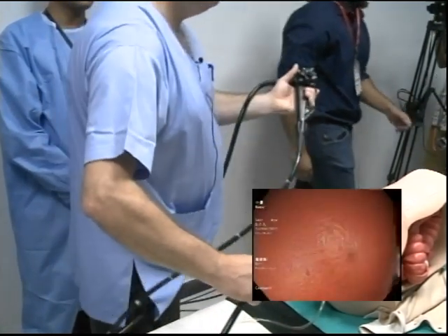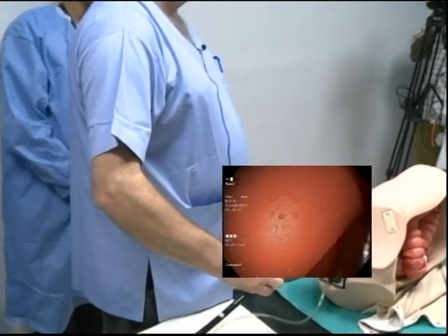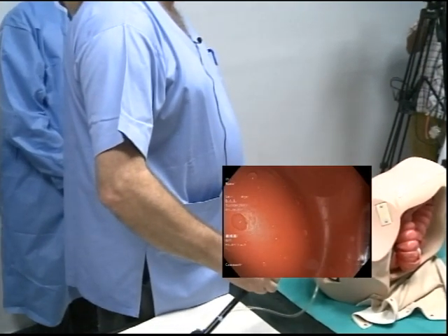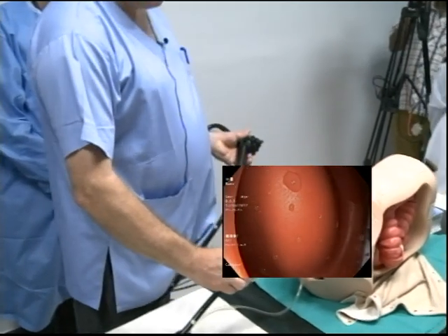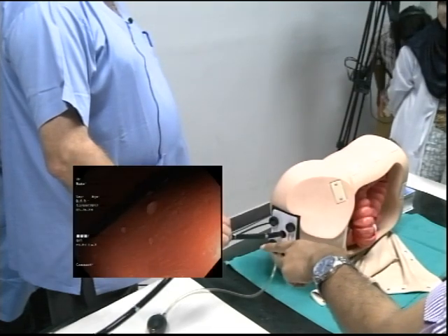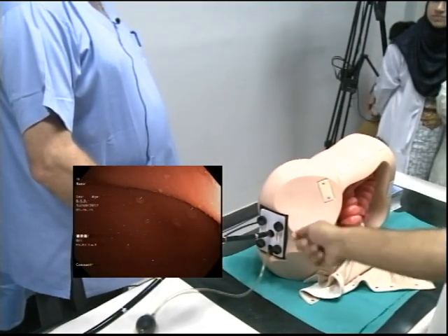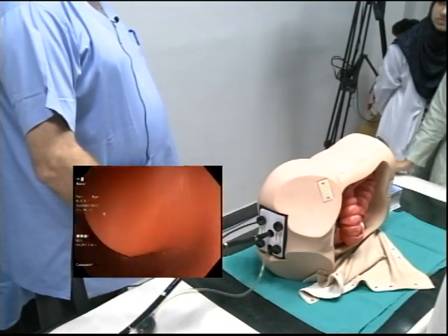Right, come back with the scope. Buttons to the floor, tip up. Buttons down, clockwise torque. See the torque? See the hand? The scope is staying straight. Can you do the torque? Torque. Look at it.